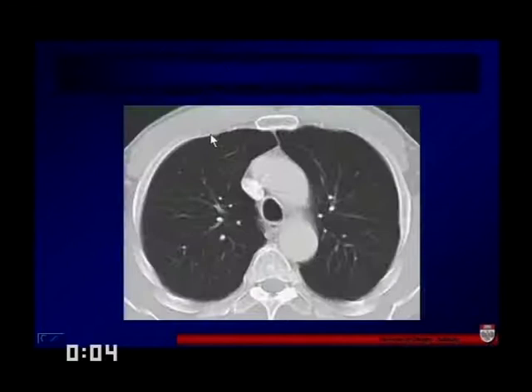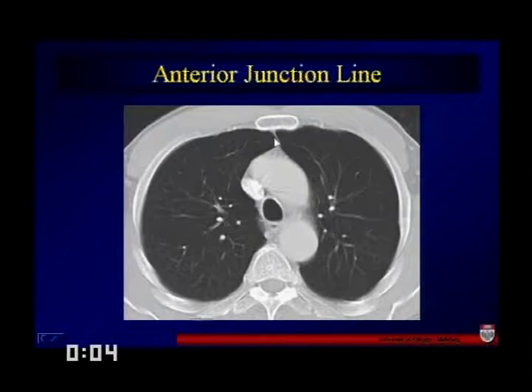In this case, we have the anterior junction line by CT. You can see this is where the lungs come together, and if there were any kind of significant anterior mediastinal mass, we wouldn't be able to see that.